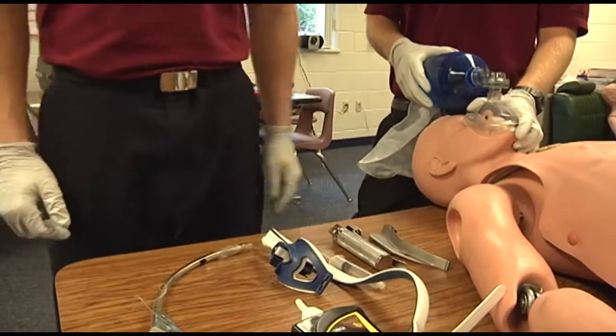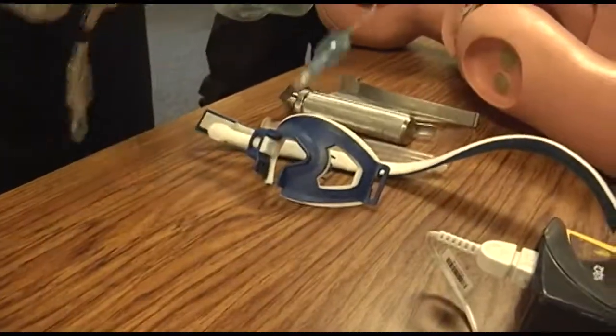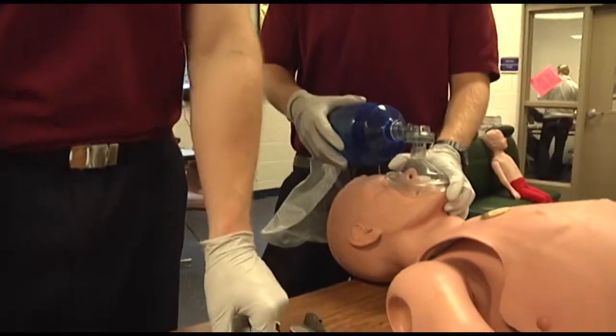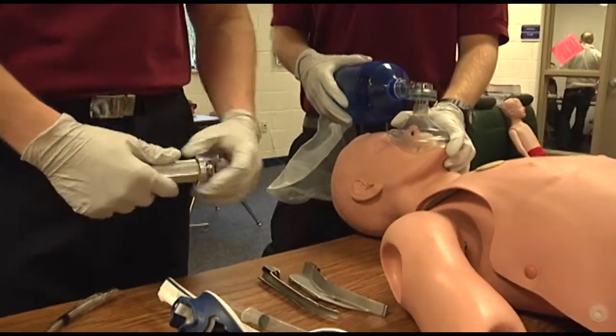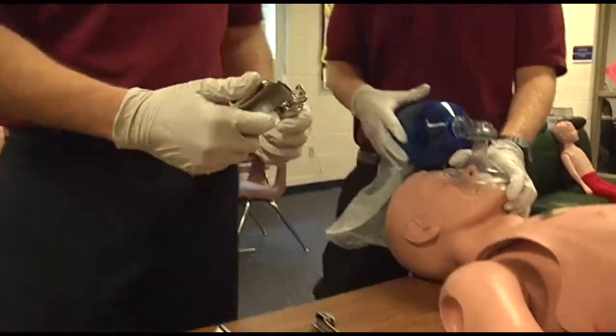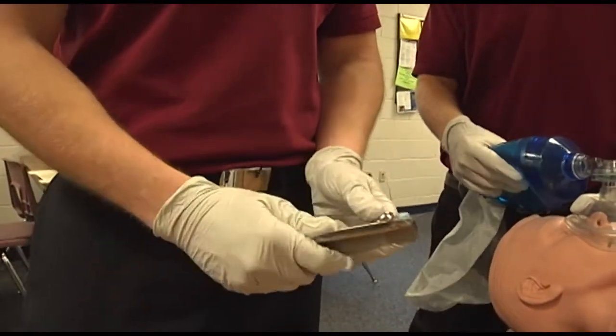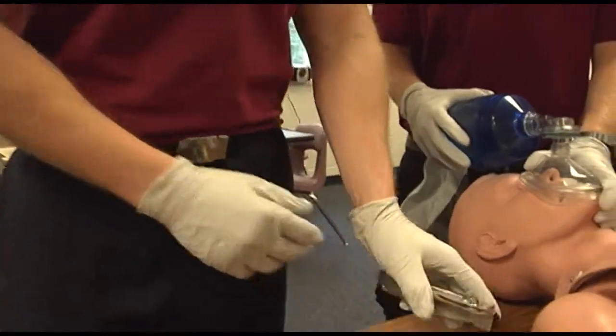Identify and select the proper equipment for intubation: an adult size ET tube, sizes seven and a half and eight, and a laryngoscope — make sure it is operational with the bulb tight. Maintain sterility of the ET tube throughout preparation.